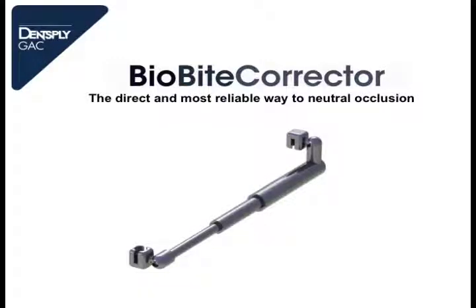Hello, today we are talking about the BioByte Corrector. The BioByte Corrector is a fixed class 2 appliance which is mounted on a multi-bracket appliance.